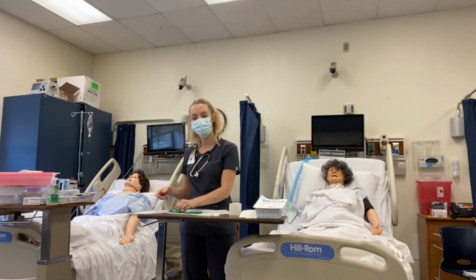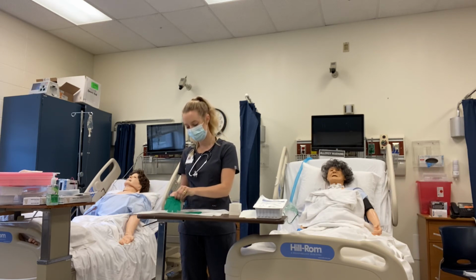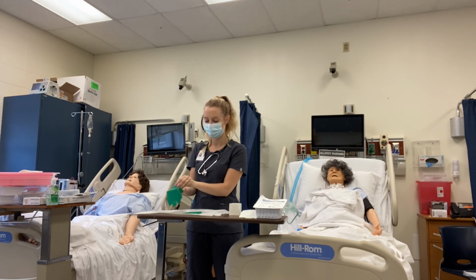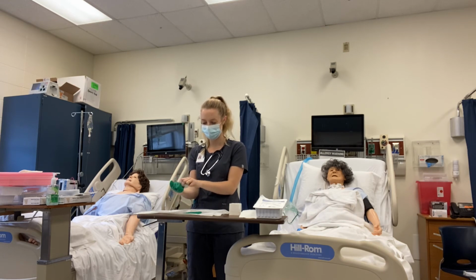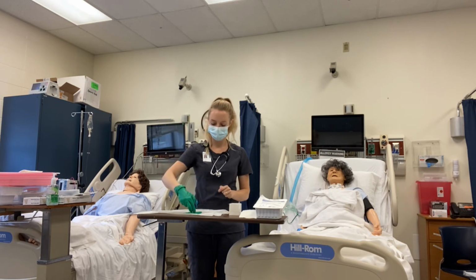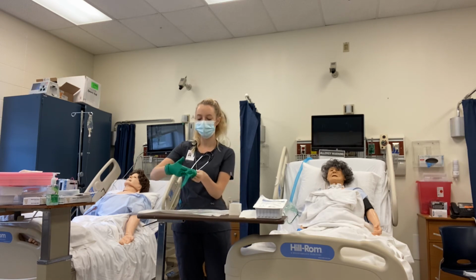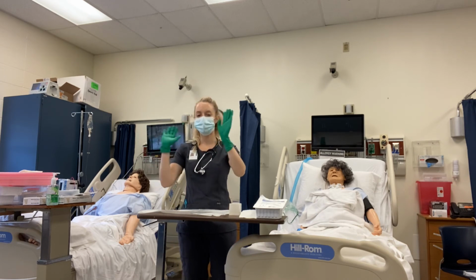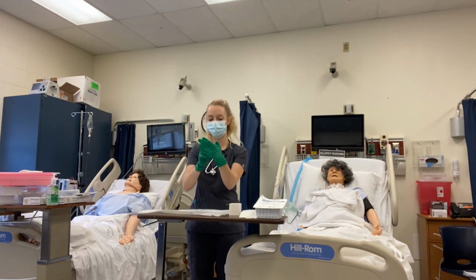I only want to pinch the cuff of my sterile glove. These are older sterile gloves. They're normally a little easier to get on. Then, keeping my hands sterile, I slide my fingers under the cuff of the other glove, being careful to mind my thumb. Once I have it on and I have both hands sterile, I can adjust my gloves.